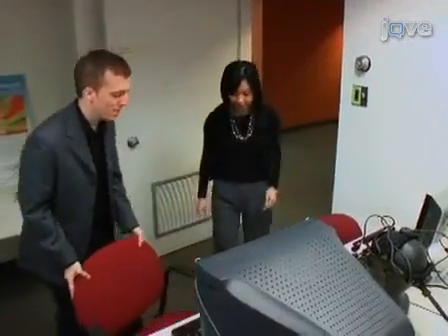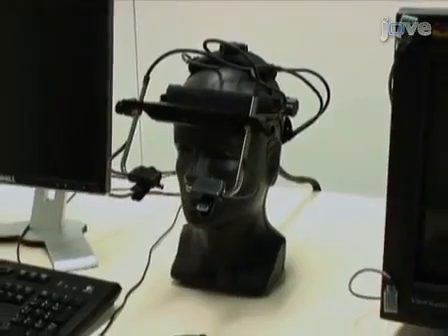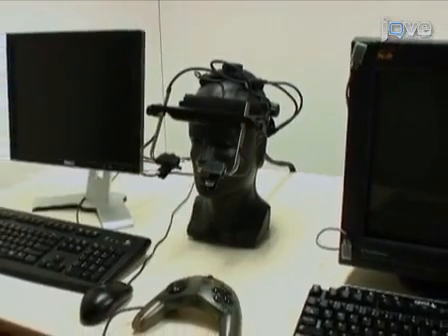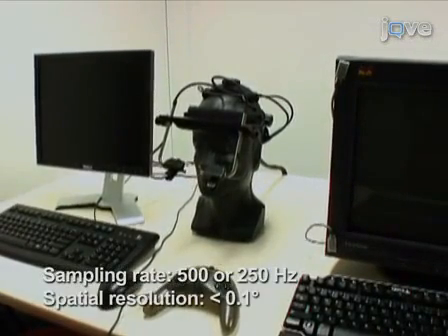To monitor eye movement during memory integrity experiments, an iLink 2 eye tracker system is used. This head-mounted, video-based eye tracker records eye position in the XY coordinate frame at a sampling rate of either 500 or 250 Hz with a spatial resolution of less than 0.1 degree.